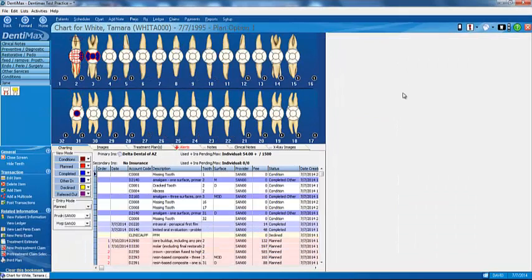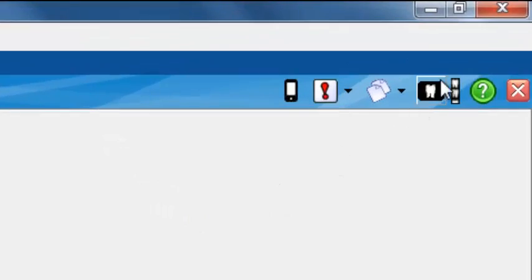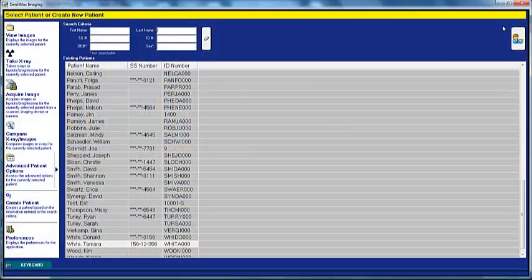Let's go ahead and show you how to take an x-ray. You can be in the charting screen or any screen for that patient, and you'll have an x-ray button in the upper right-hand corner. Simply click on that button to pull up our digital imaging program.